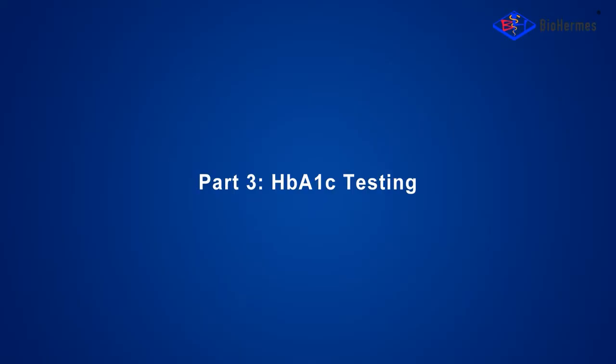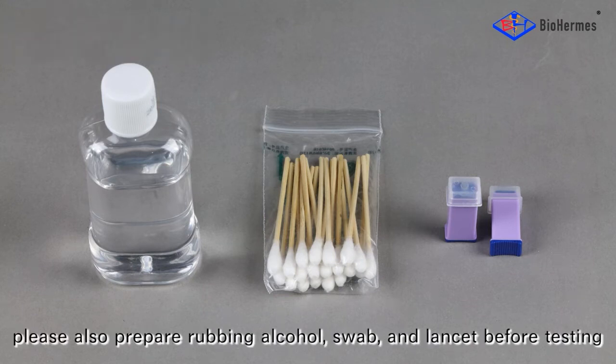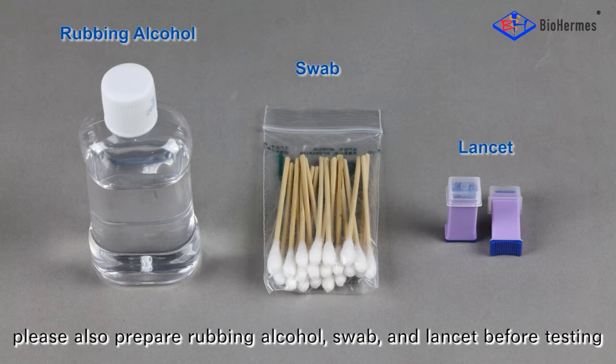Part 3: HbA1C Testing — Preparation. Besides the glycohemoglobin analysis system, please also prepare rubbing alcohol, a swab, and a lancet before testing.